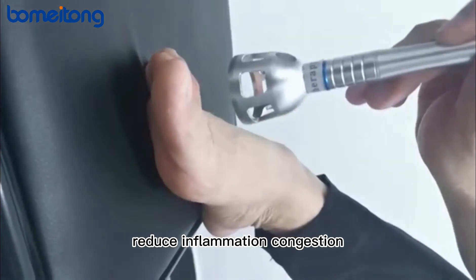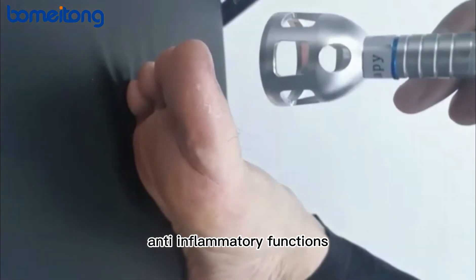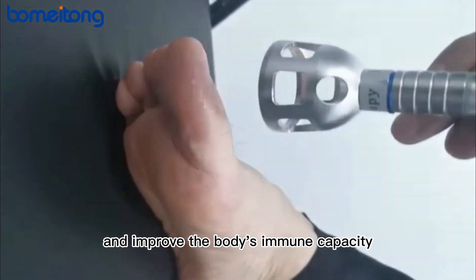Enhance the body's sterilization and immune function, reduce inflammation, congestion, exudation, and edema through anti-inflammatory functions, and improve the body's overall immune capacity.